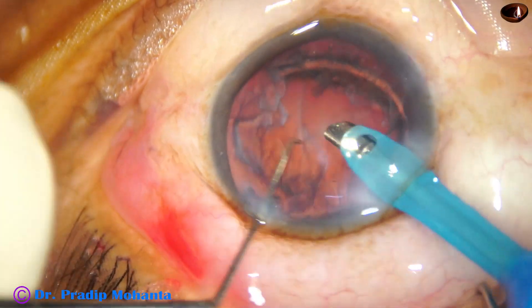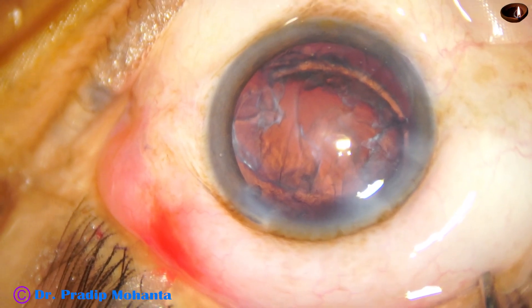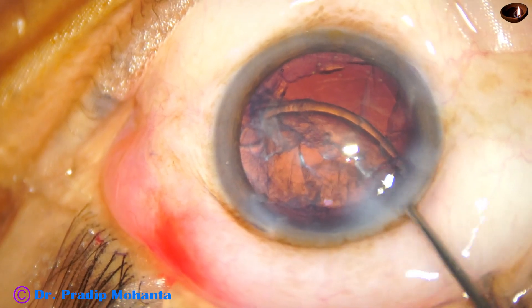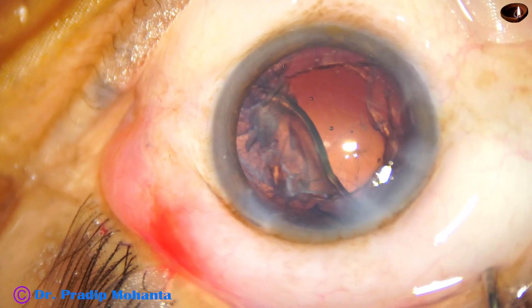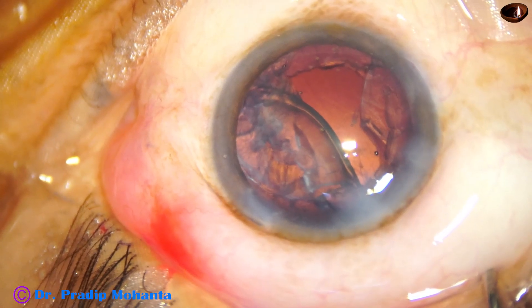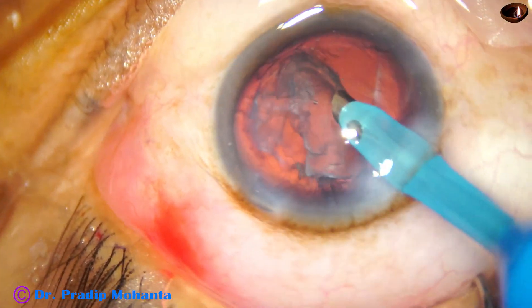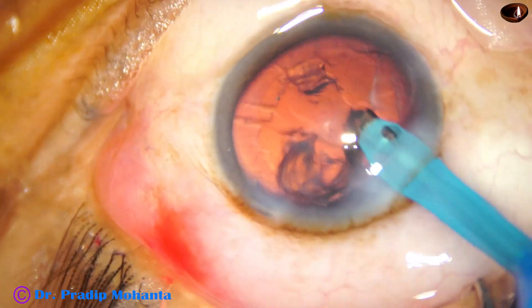Now this is the epinuclear shell. Don't try to grab this in your initial few surgeries. Inject Visco behind the epinucleus and then go with the handpiece again. Use low vacuum and low flow rate — vacuum maybe 100 or 120, flow rate about 25 — to remove the epinucleus.